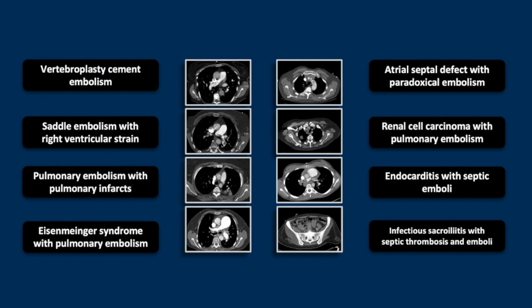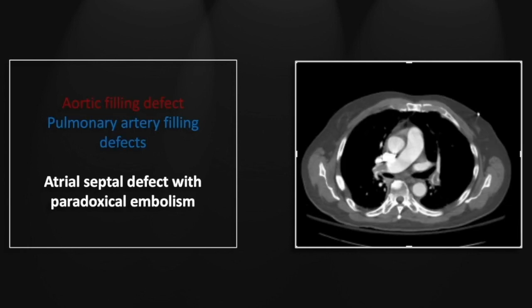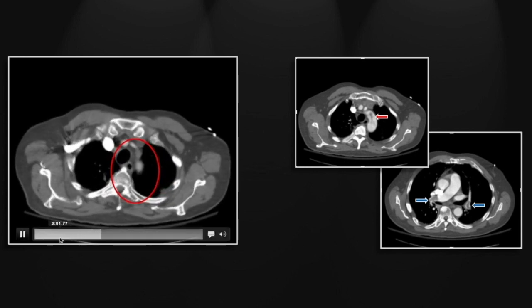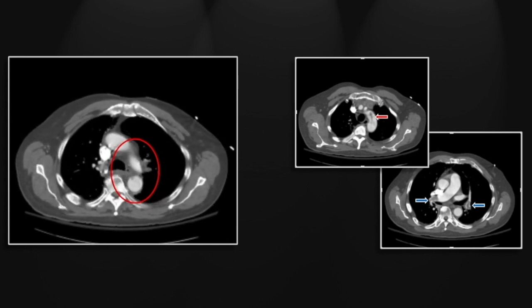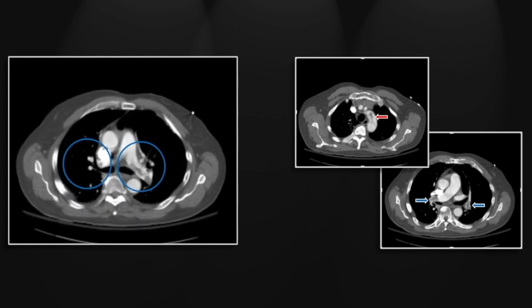Our next case is an atrial septal defect with paradoxical embolism. There is an unusually configured filling defect in the aortic arch itself, which extends up into the left subclavian as well. There are extensive filling defects throughout the pulmonary arteries. These findings are obviously linked: the left subclavian occlusion, the filling defect within the aortic arch, and the filling defects throughout the pulmonary arteries.